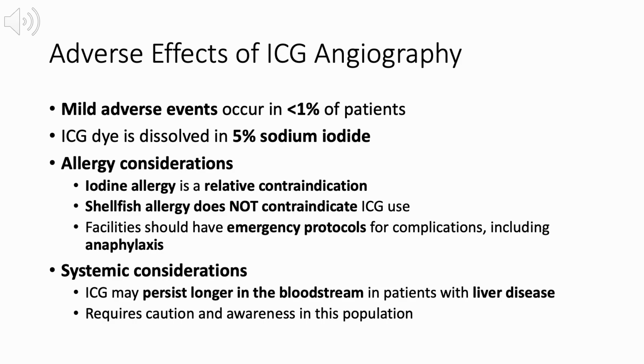As with any dye-based angiographic study, it is important to be aware of the potential adverse effects of indocyanine green angiography. Mild adverse events are uncommon, occurring in less than 1% of patients. Indocyanine green dye is dissolved in 5% sodium iodide, which has implications for patient screening. Allergy considerations are particularly important. An iodine allergy is considered a relative contraindication to ICGA angiography, whereas a shellfish allergy does not contraindicate ICG use. Facilities performing ICGA should have appropriate emergency protocols in place to manage rare but serious complications, including anaphylaxis.